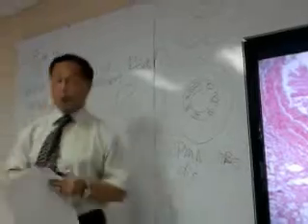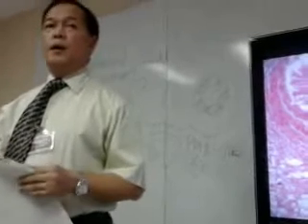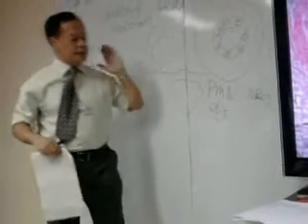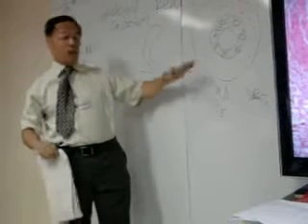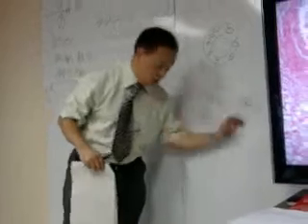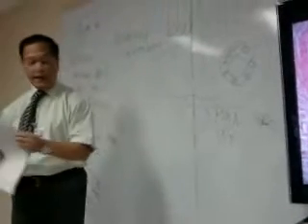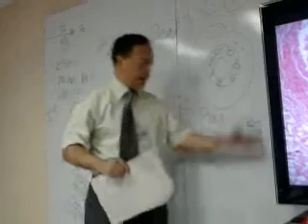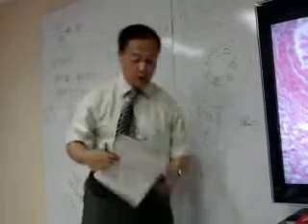Question: acute or chronic? Acute. Why acute? This should be your answer: this is acute because I'm seeing polymorphonuclear leukocytes or WBC. Kindly complete the word: polymorphonuclear leukocytes or WBC.